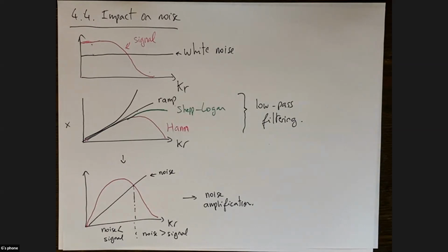For that reason, you'll never really see them reconstruct using a ramp filter unless you have a huge number of counts for some reason, or maybe you're reconstructing a point source or something like that. Usually you won't ever use a ramp. You'll always roll it off, like the Shepp-Logan and Hann filters that Gam is showing you, to mitigate noise with the knowledge that you're going to slightly blur out sharp edges that are real signal. It's just because the noise actually ends up being a bigger problem. I see. Thanks. That makes a lot of sense.